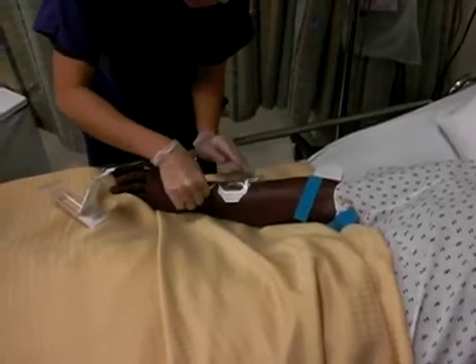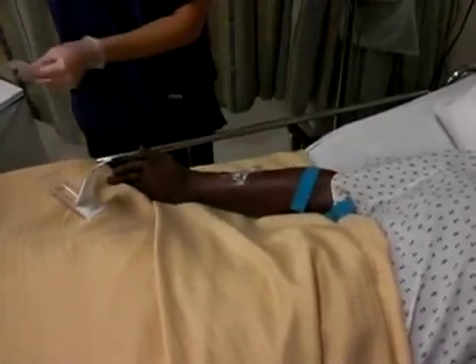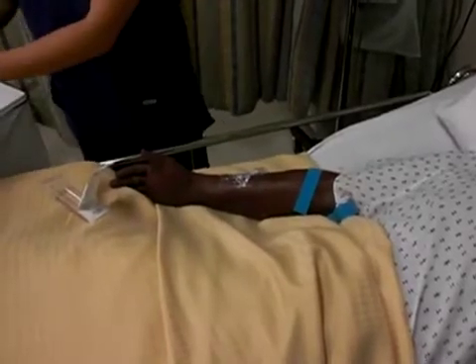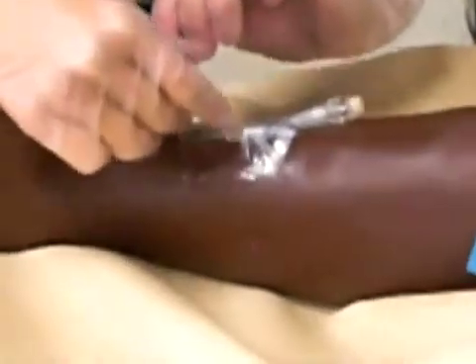Tape is placed over the transparent dressing and date and time of placement is recorded with the nurse's initials. Now the nurse is ready to connect the saline lock to the primary infusion tubing.